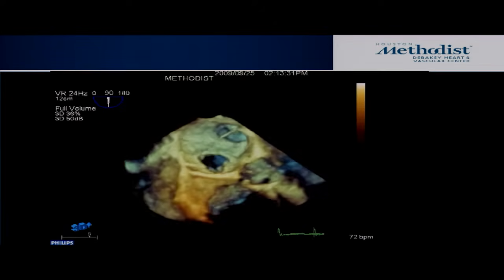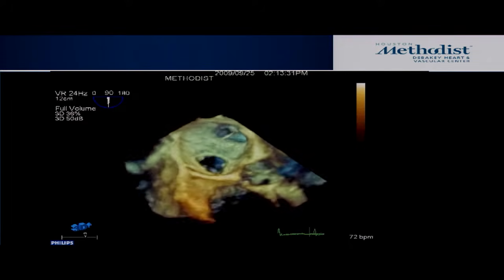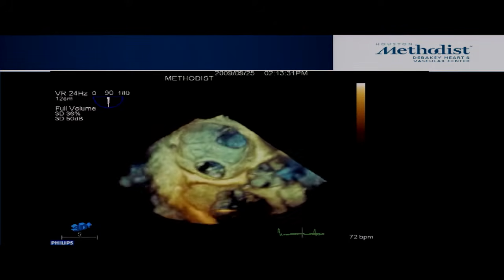Yeah. Is there any guidance or cutoff as to how much thickness for how long? Because you typically do these studies. Not really, because it varies by age. It varies by how much they get inflamed. It varies by probably surgical technique, if there's a lot of blood in the field or bloodless, or even probably the type of prosthetic valve. I think it's more the clinical scenario.